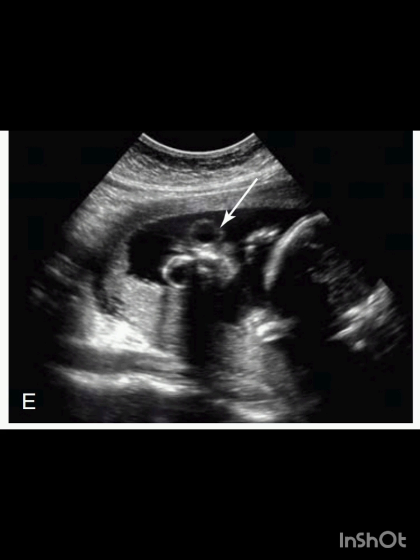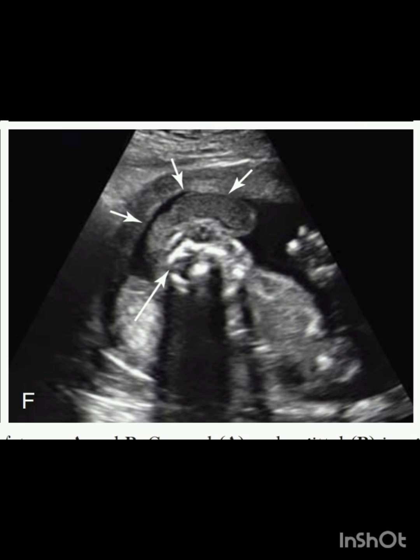This image of anencephaly shows the classic craniofacial structure in anencephaly, which is called the frog-like configuration. This is a coronal image of a different fetus with anencephaly demonstrating no calvarium above the level of the orbits. There is a large amount of dysmorphic appearing tissue corresponding to angiomatous stroma, extending superiorly and laterally to the head, as indicated by the arrows.